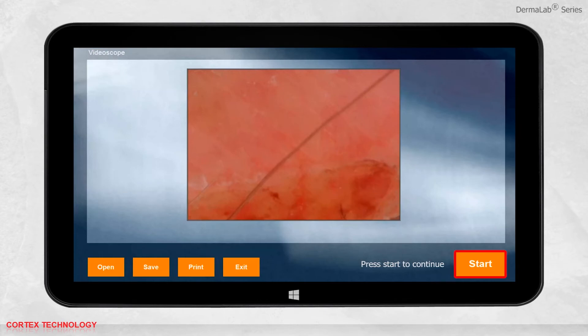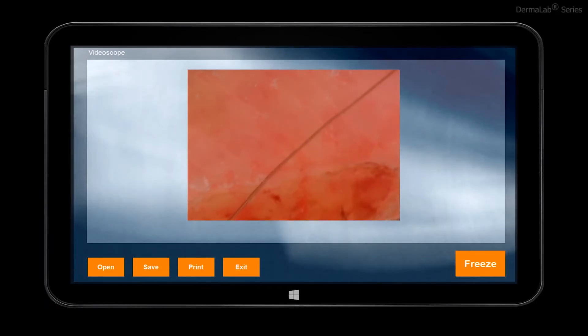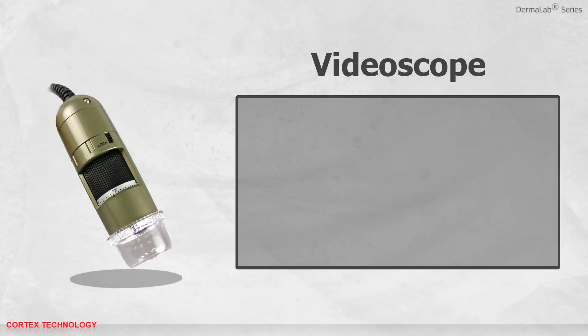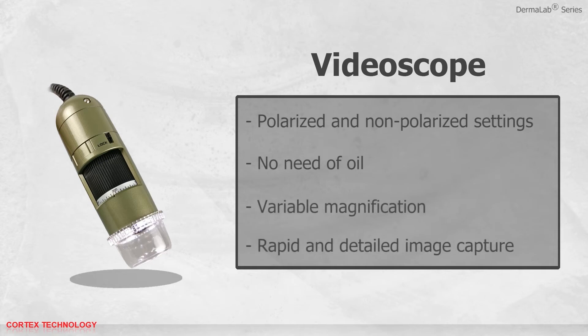Just press the start button again to continue the video. The video scope comes with polarized and non-polarized settings. The polarized setting eliminates surface reflections and removes the need for oil. It has variable magnification and can do rapid and detailed image capture.